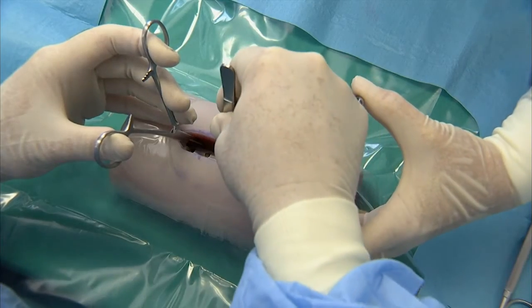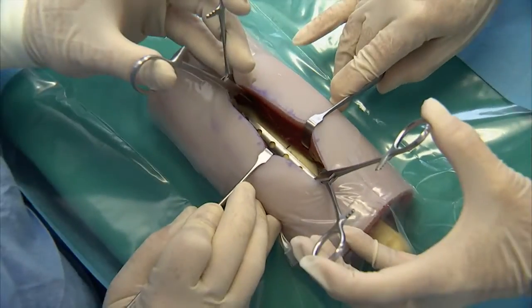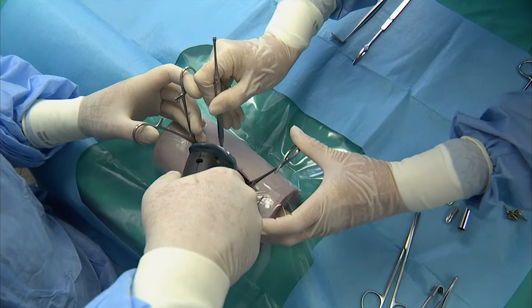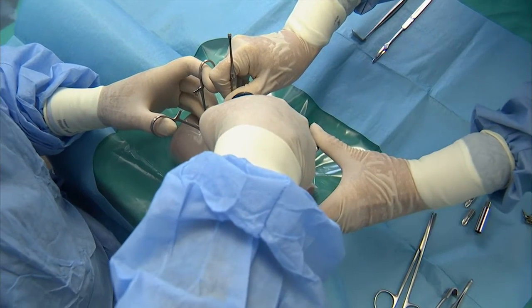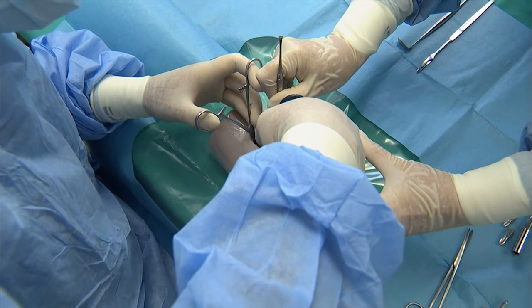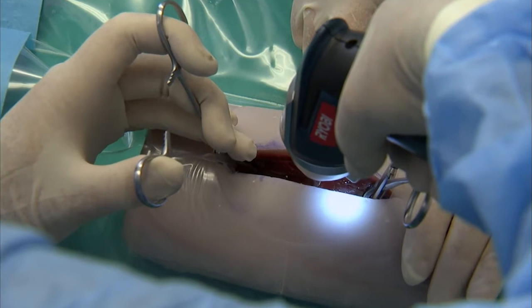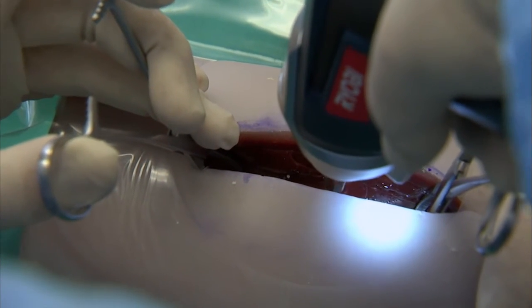Position the plate such as to ensure that there are the same numbers of holes on either sides of the fracture. Hold the plate in position and stabilize it with a suitable instrument. The assistant aids by stabilizing the bone segments and keeps them in position with a repositioning forceps. Drill monocortical holes and place the bone screws one by one.